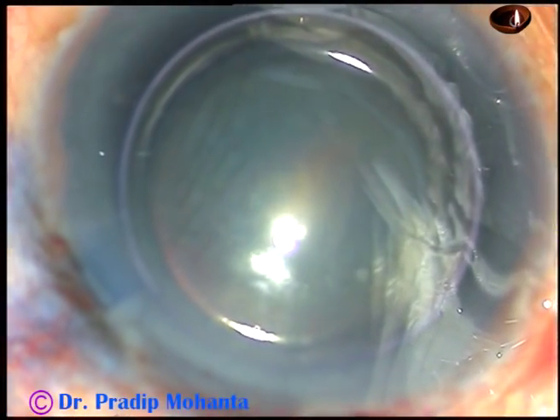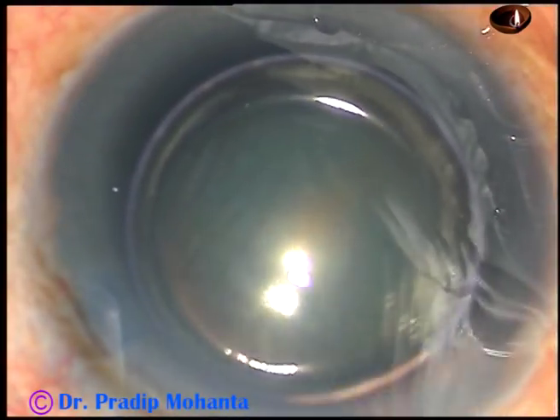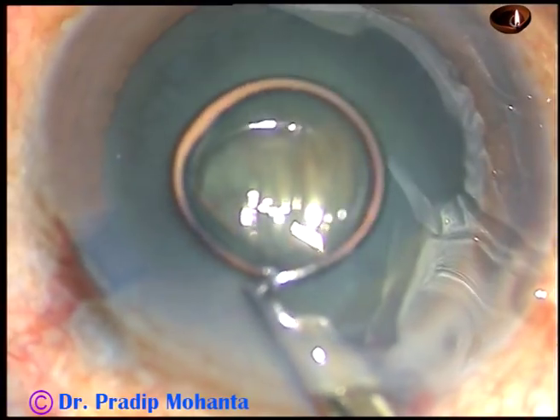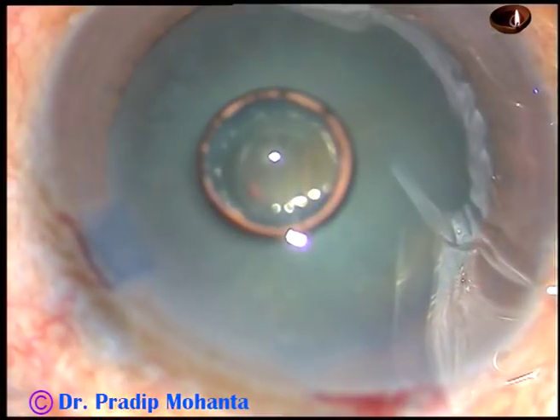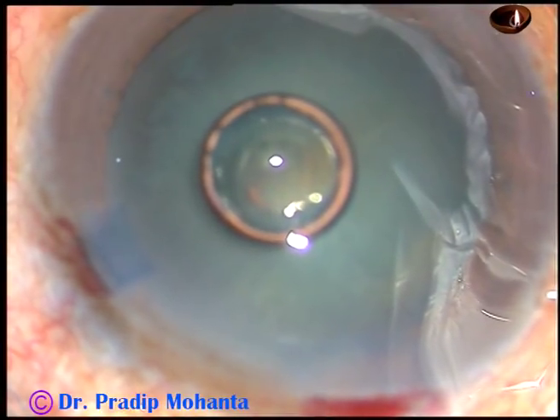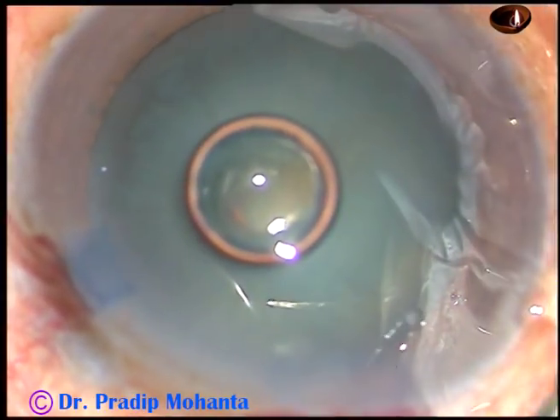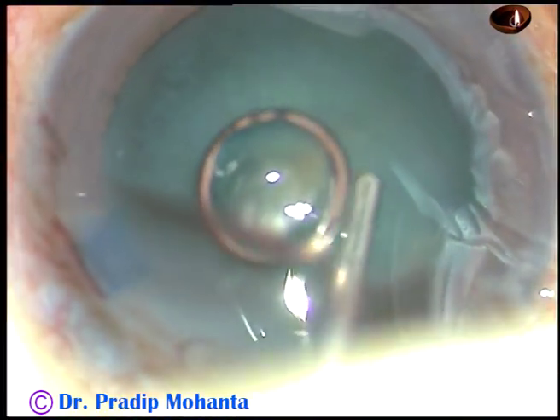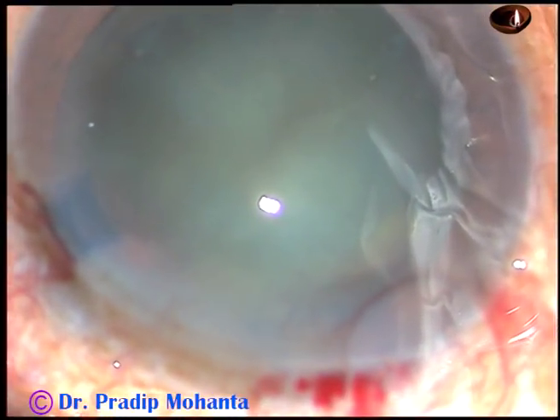Let us observe the surgery. By this time, the main incision and one side port has been made. The capsule has been stained with trypan blue dye. The dye has been washed out. And now 2% hydroxypropyl methylcellulose is being injected and the anterior chamber is being filled up with this viscoelastic substance.